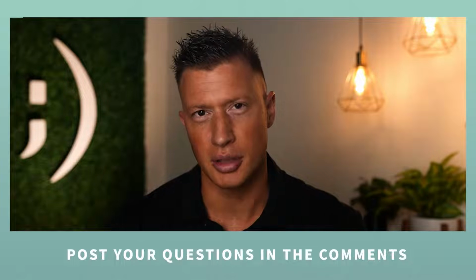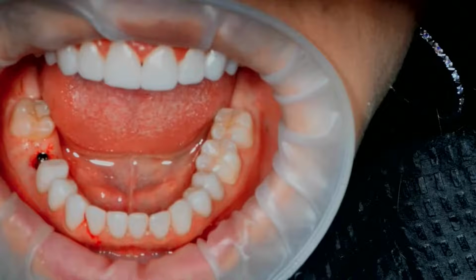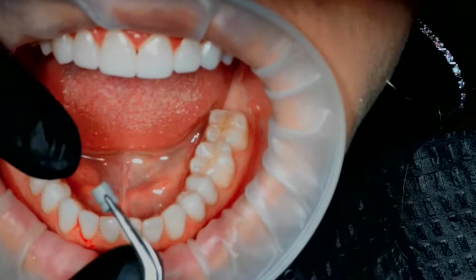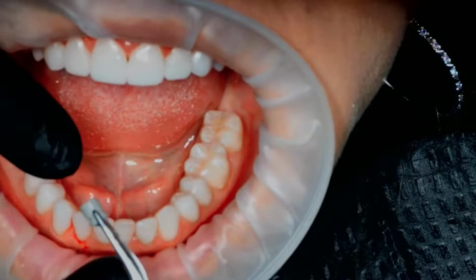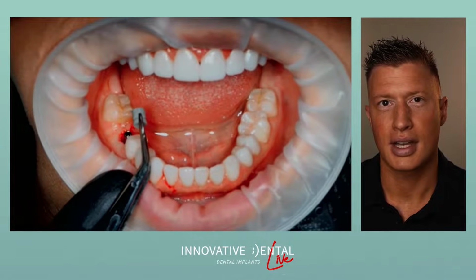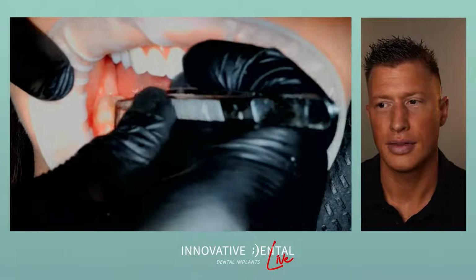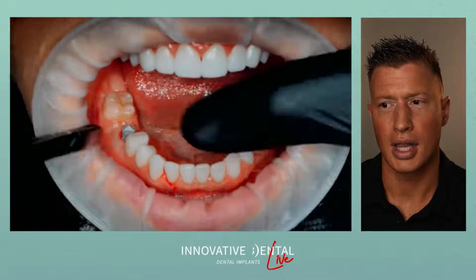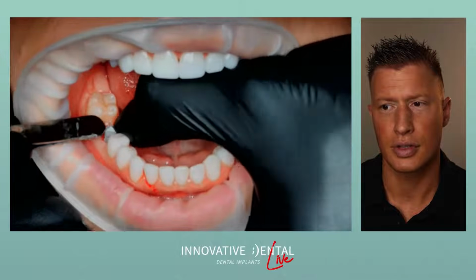So check this out. We're going to take the impression, design the crown. And so we just have to nail this position, take our impression. That little device there is called a scan body. So I'm going to take this scan body and we're going to put it on top of this titanium base. I'm going to line it up and make sure that it's fully seated.